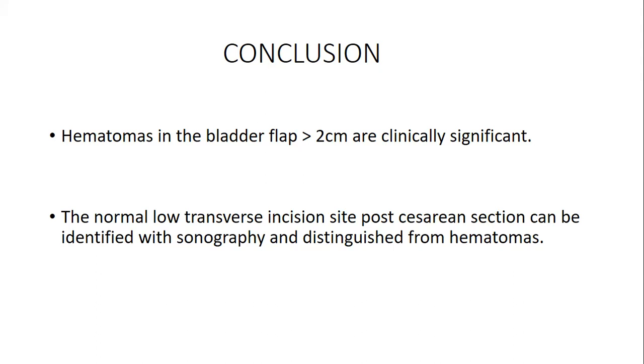Sorry, I think there is one image that I needed to show you. But the take-home message is that as you do your sonography, you must remember that these sonographic techniques can help and guide clinicians to give the appropriate decisions when it comes to treatment. Not only that, our technique in sonography must also be very, very accurate and use the appropriate techniques.